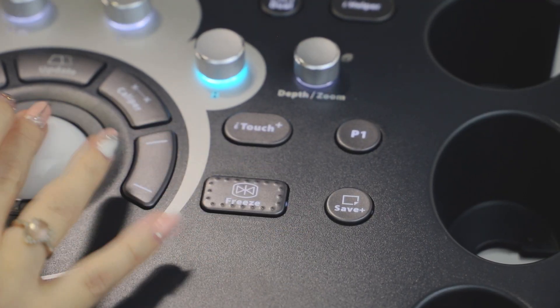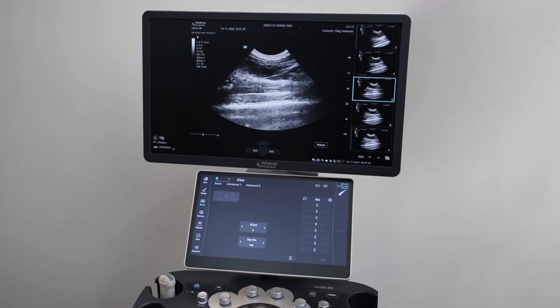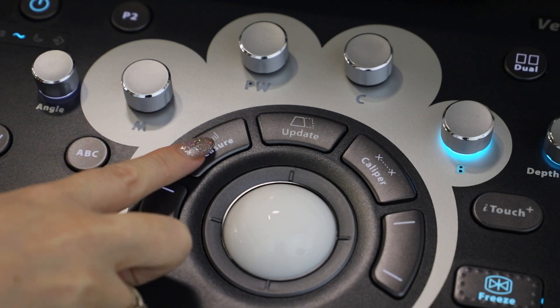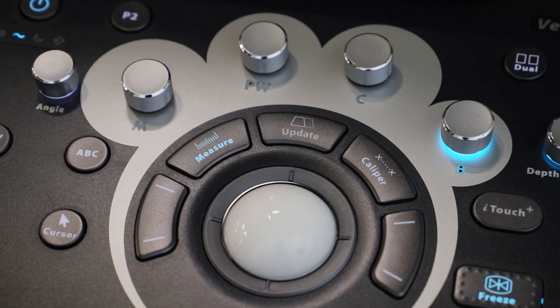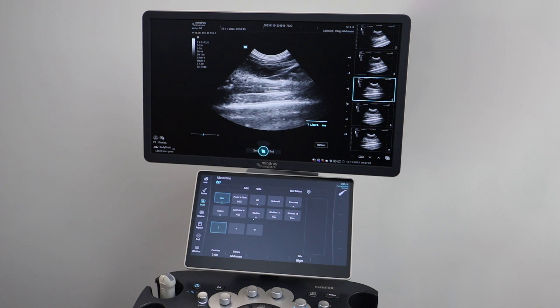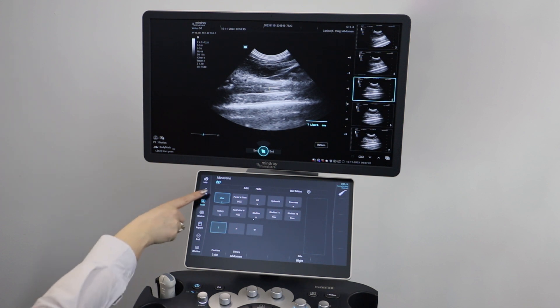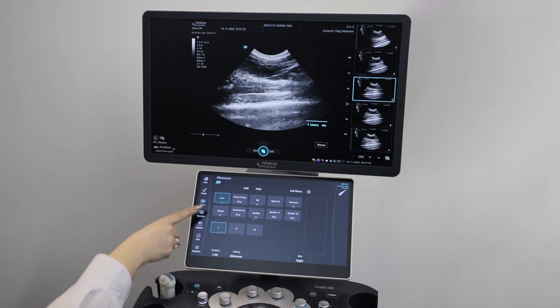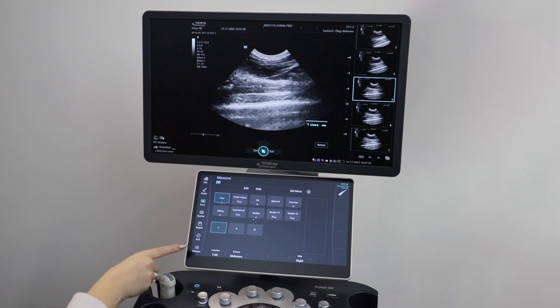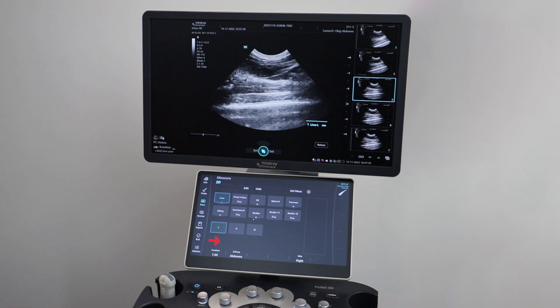To create a labelled measurement, freeze your image and click measure. On the small screen, a library of labelled measurements in centimetres will be available. You can scroll through more options by swiping right.